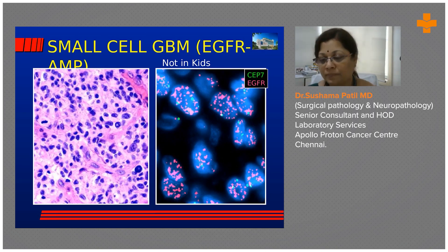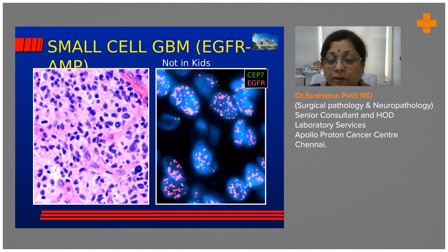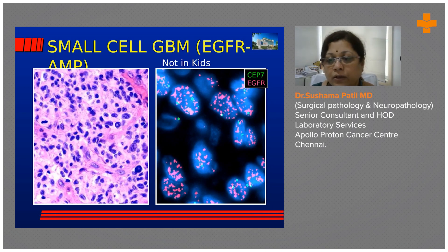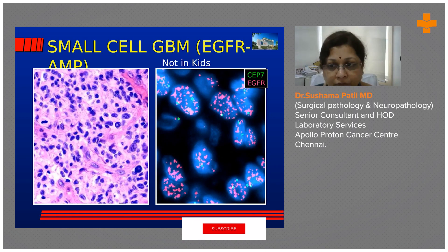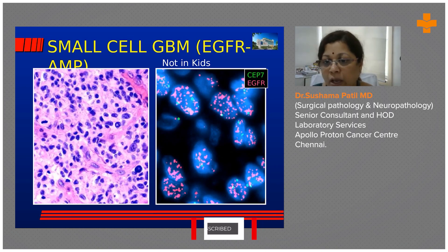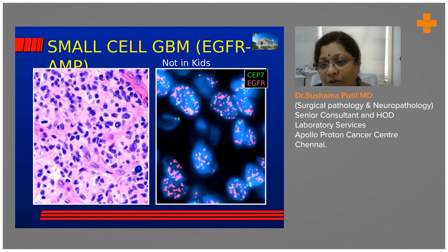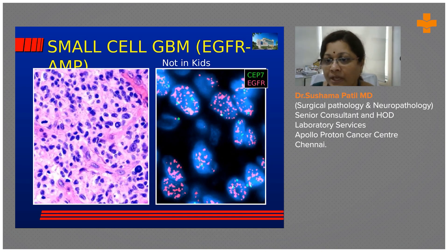Each CEP probe is chromosome-specific. In this case, we use the chromosome 7 centromere probe as reference. Normal dosage is two signals — one pair of chromosome 7 — so you should see only two green signals. But when you start seeing more than two signals, we are dealing with trisomy, tetrasomy, or polysomy.